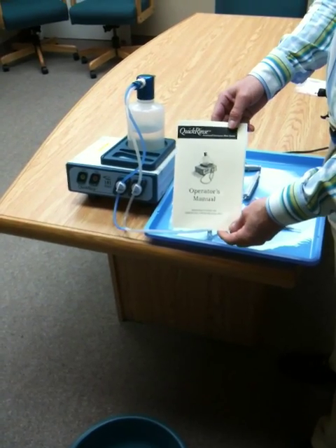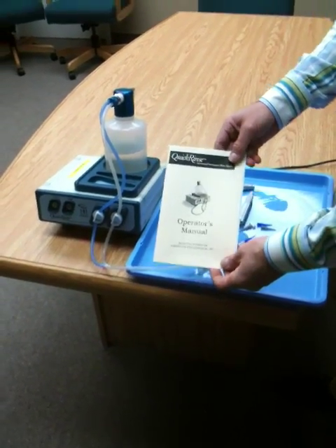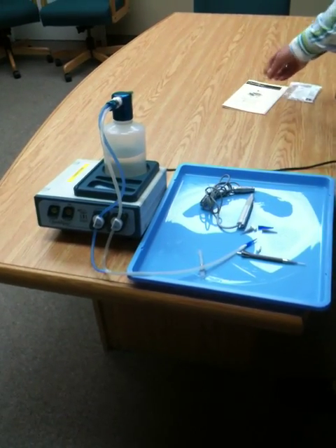This is the Quick Rinse Automated Rinse System manufactured by American Opti-Surgical. This segment will cover troubleshooting and helpful hints.